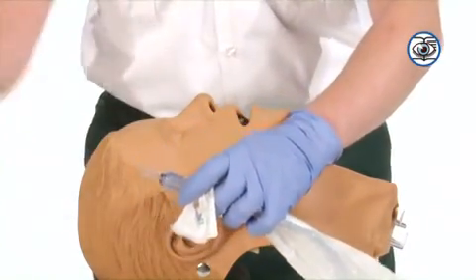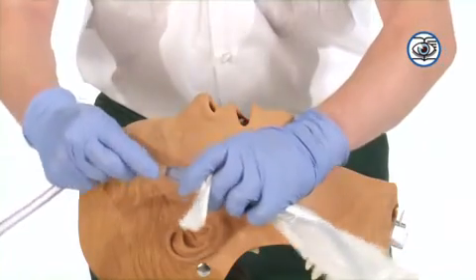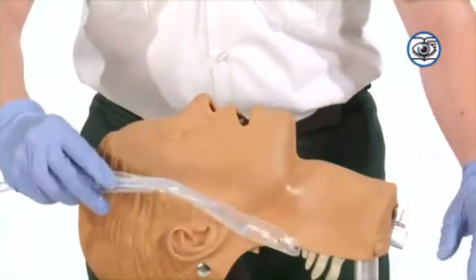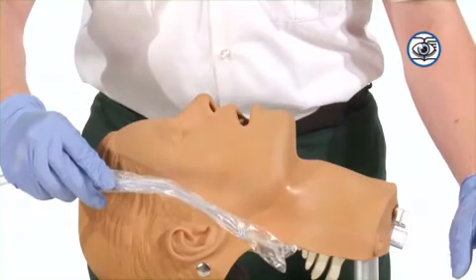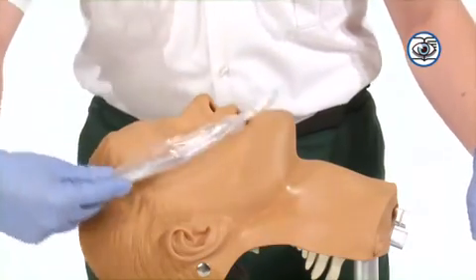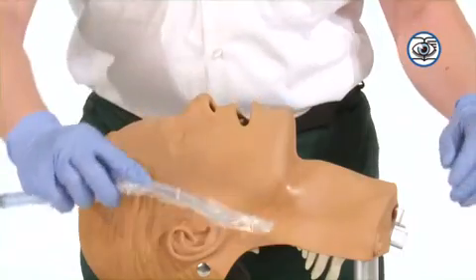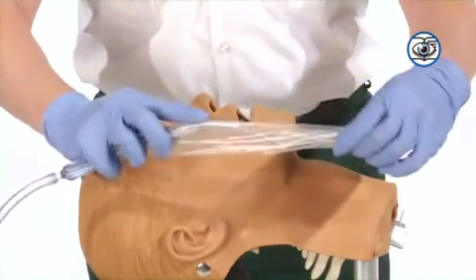In either case, the catheter must first be measured by placing it along the patient's jawline with tip resting on the corner of the mouth. The measurement is taken at the angle of the jaw. CFR providers must never advance the catheter further than the measured length.